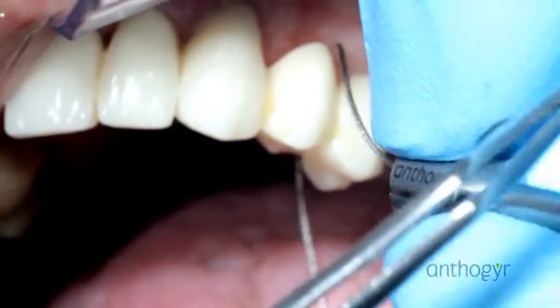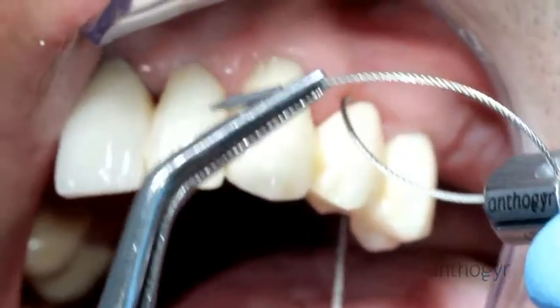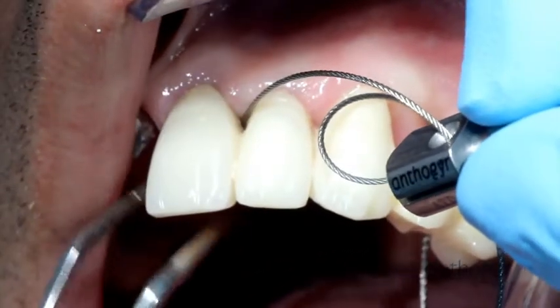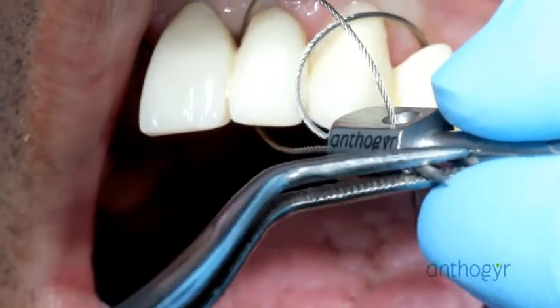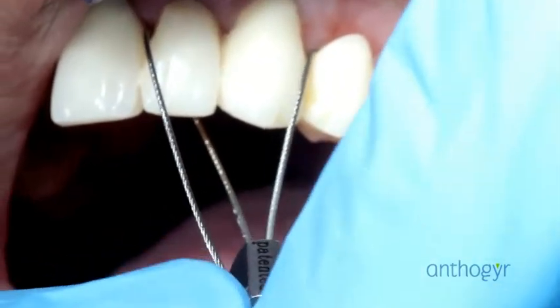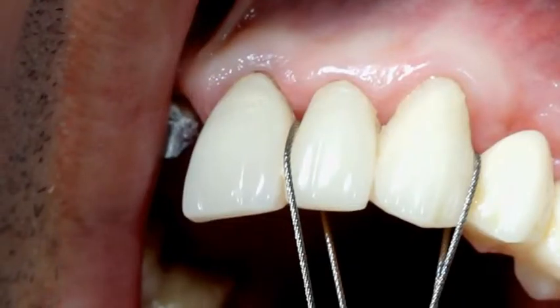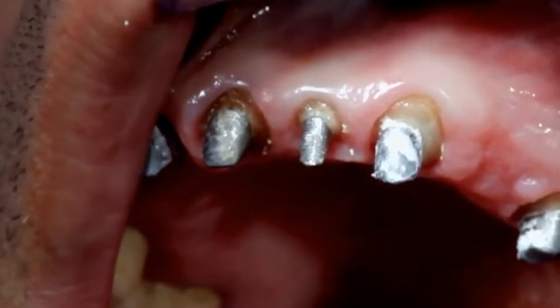The cable is first inserted in the most distal embrasure at the level of the first premolar. It's then passed through the mesial embrasure at the level of the lateral incisor. Then the pointed end is inserted in the groove. The pointed end is then inserted through the gap. This is then connected to the SafeRelax and traction is applied. The bridge is loosened in a few seconds. It can be noted that there's no damage to the abutments.